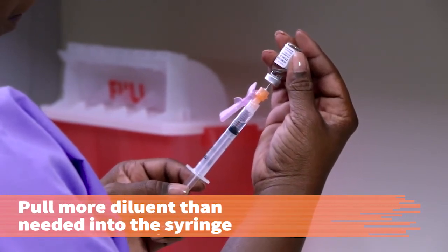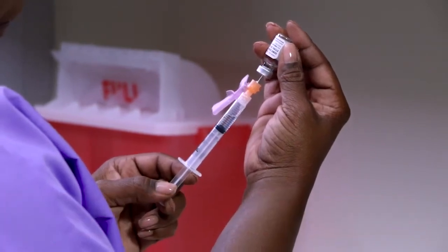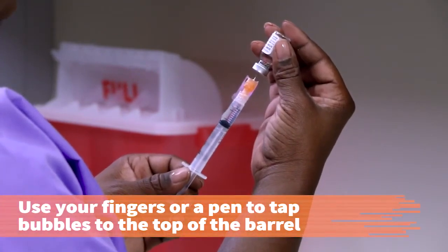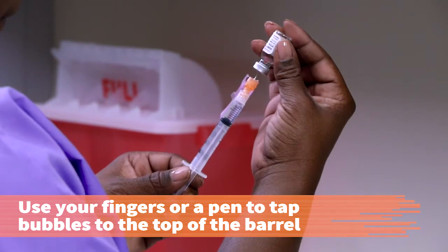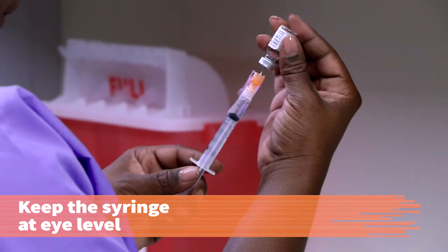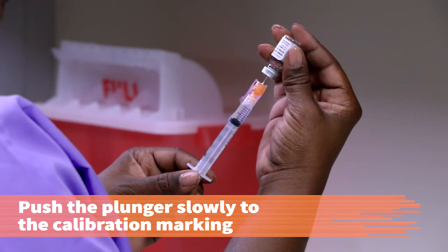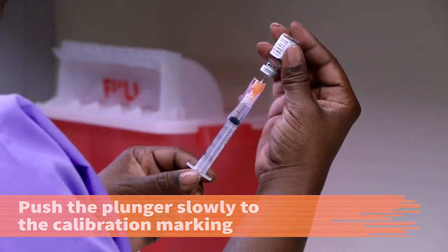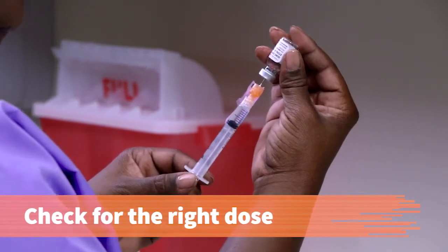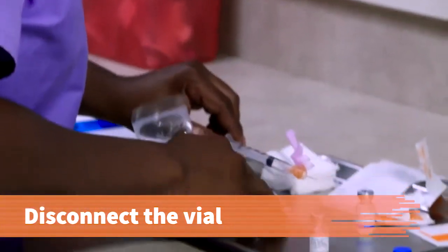Pull down on the plunger until you have more diluent than what you need. Continue to hold the vial and syringe unit in a vertical position with the needle pointing upward. With your dominant hand, use either your fingers or a pen to tap the bubbles to the top of the barrel. Keep the syringe at eye level. Once all the air bubbles are at the top, push the plunger slowly to the correct calibration marking for the ordered dose. Double check that no air bubbles are in the syringe and that the right dose was measured. If everything is correct, disconnect the vial from the syringe and needle unit.